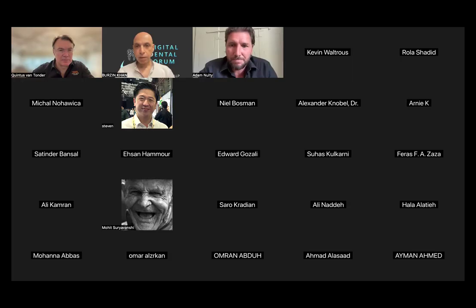I think there's one more question, Adam. Just to wrap up what you just mentioned, I think your prototype using the Ti base would be a good verification jig as well as an aesthetic check and a functional check that you can do in the patient. So I think that's a combination that we can do.